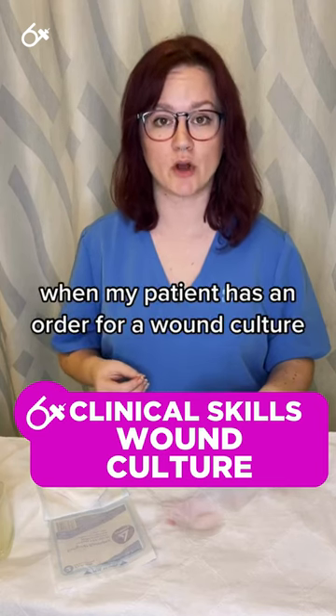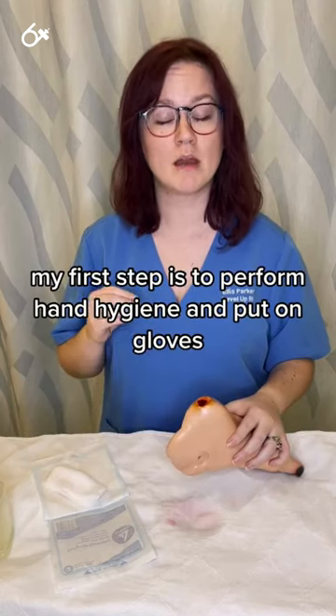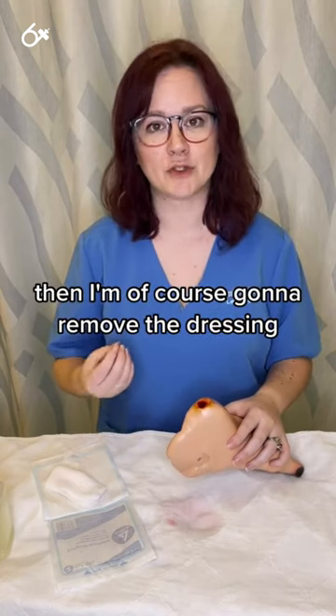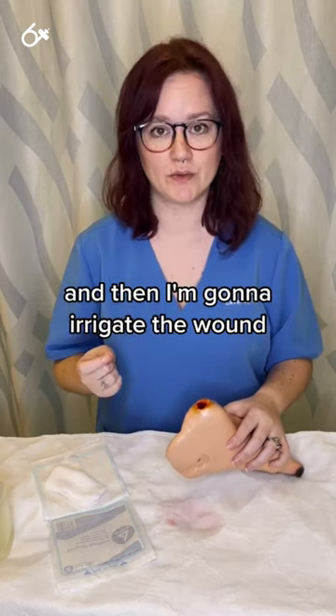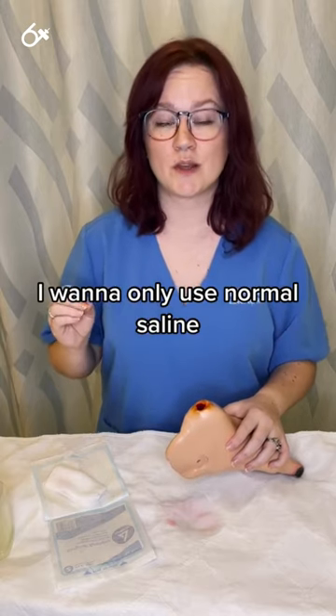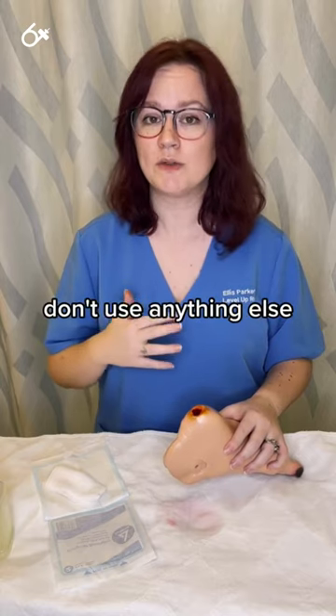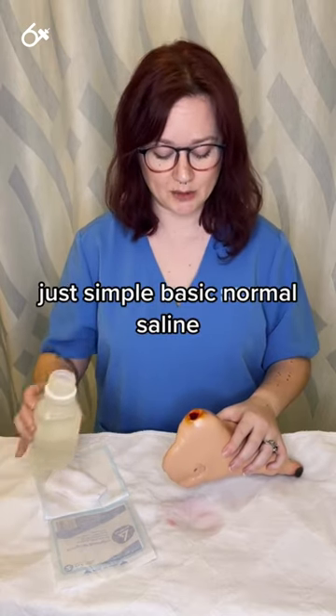When my patient has an order for a wound culture, my first step is to perform hand hygiene and put on gloves. Then I'm going to remove the dressing and irrigate the wound. I want to only use normal saline — do not use wound cleanser, do not use Dakin's, don't use anything else. Just simple, basic normal saline.